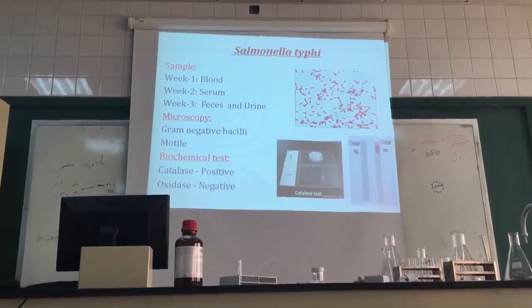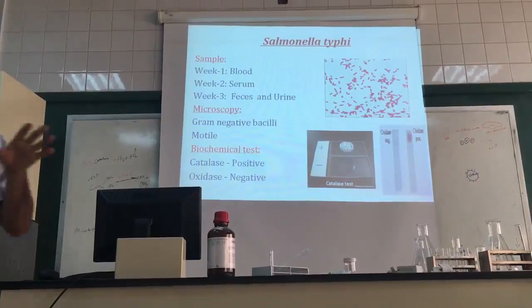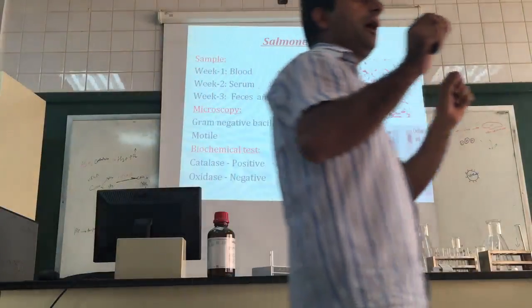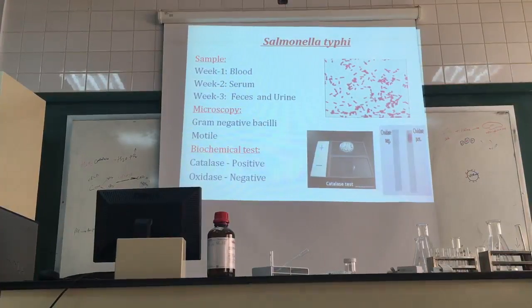Collection of sample. I did not set this up. Every time when we go for sample collection, there are certain procedures, okay? I did not set it because you have already been taught from the first year that there should be gloves and the proper site of collection of the sample. For example, somebody is having a urine infection. You cannot write as a doctor, go and test for the blood, okay? Proper sample, proper collection, proper location is important.